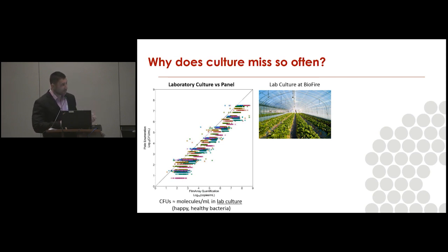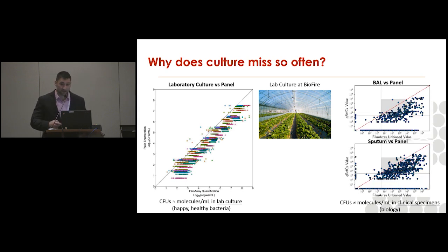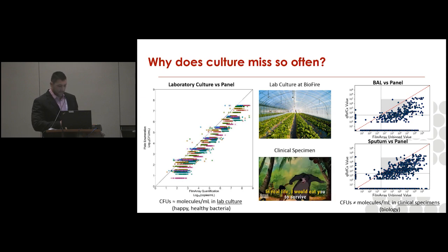We have these organisms that are grown in pure culture, they're harvested at log phase, they're in a nutrient-rich media, and basically it's the most ideal conditions for every genome to create a colony-forming unit. And so it doesn't get better than that. But in our clinical data, we've got biology going on. So here are the same type of scatter plot of the FilmArray quantified raw value versus the reference culture value. And you can see that it's just a big smear. It's not linear. And that's because clinical specimens, it's the jungle. So you've got all these biological factors, patients on antibiotics, patients who've been sick for various amounts of time, different immune response, many different factors that could result in loss of viability of these organisms and why they're not being cultured out. So that was a bigger discrepancy than we were expecting.